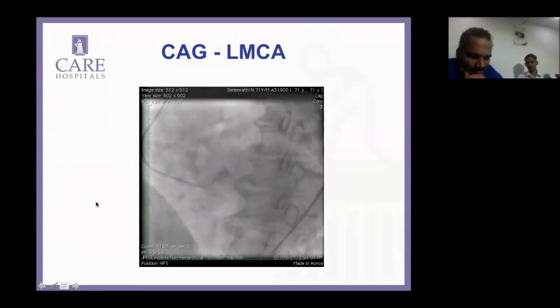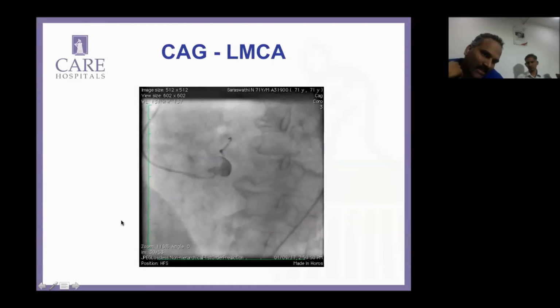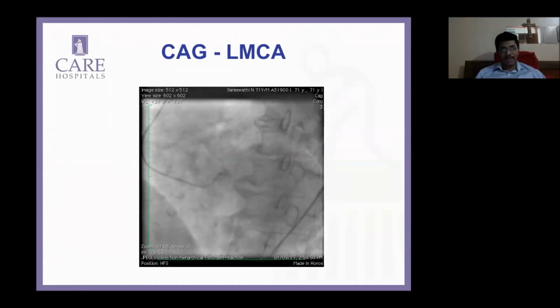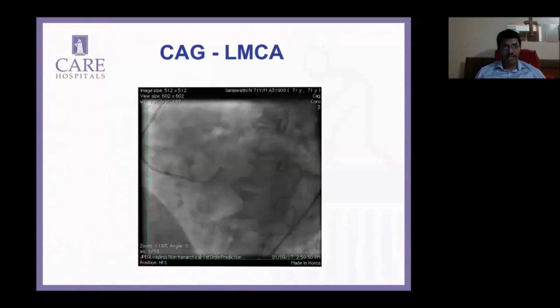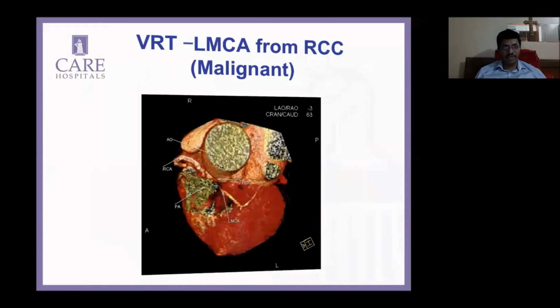That could be an LAD. Possibly. But based on that one picture, that was the last picture, incidentally, we were in no mood to make a diagnosis. So it's very difficult. It was a tough patient, and he just gave up and said, "John, just deal with it."